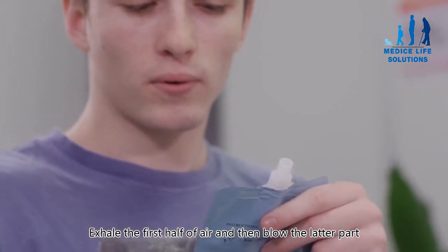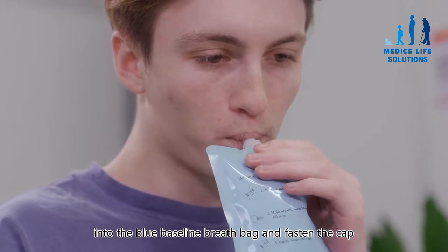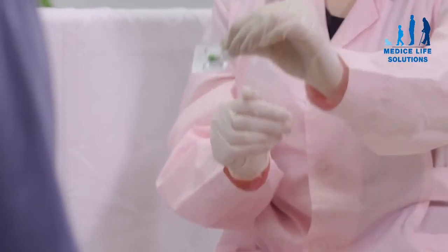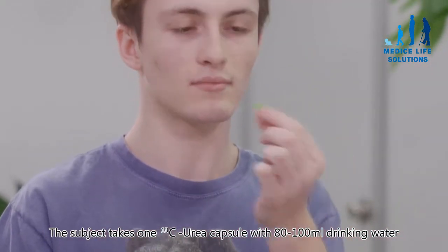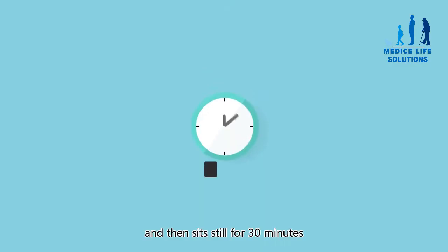Exhale the first half of air, and then blow the latter part into the blue baseline breath bag and fasten the cap. The subject then takes one carbon-13 urea capsule with 80 to 100 milliliters of drinking water.